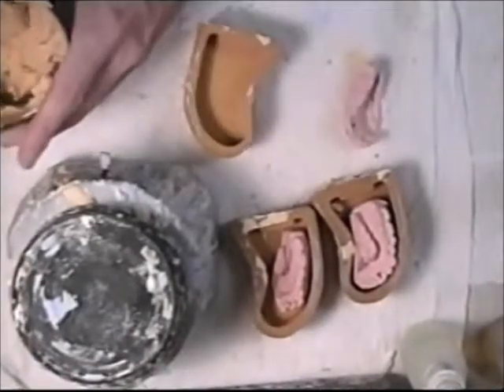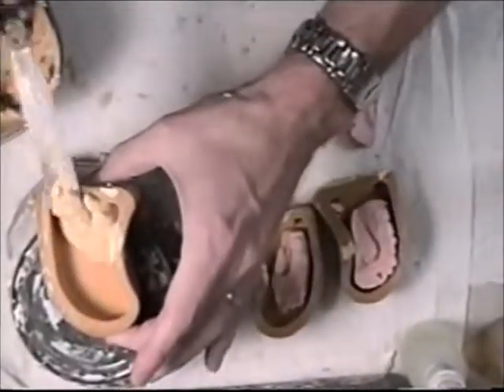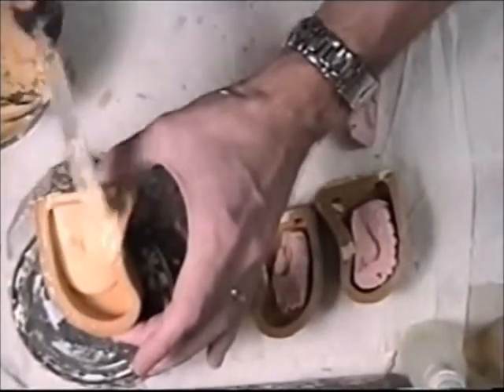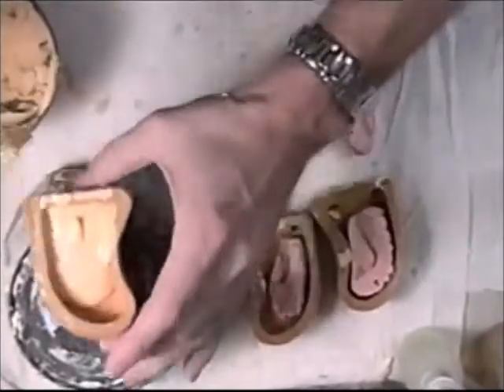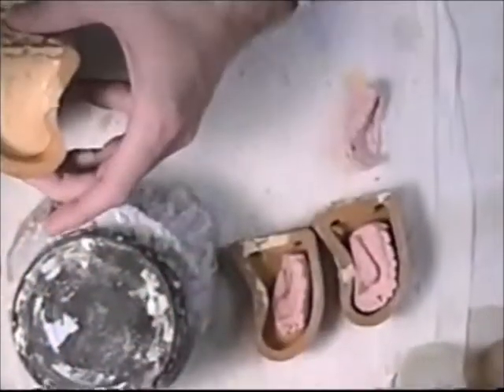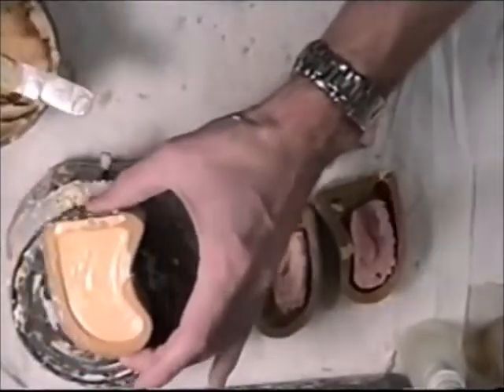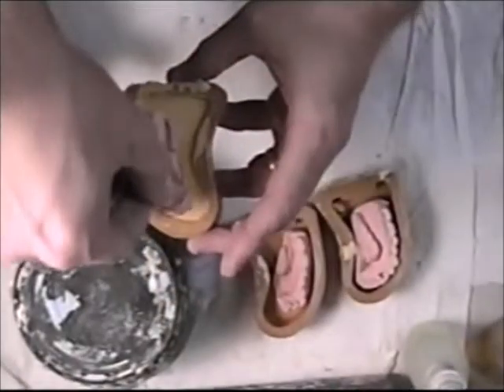Then on the opposing, you can just fill the rubber molds up and just set them right on top.